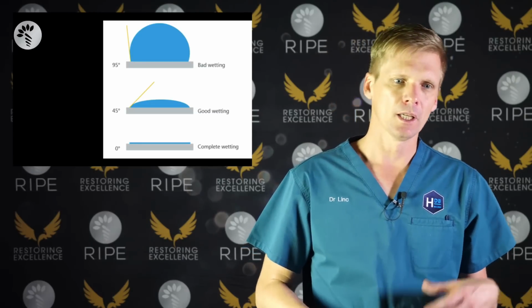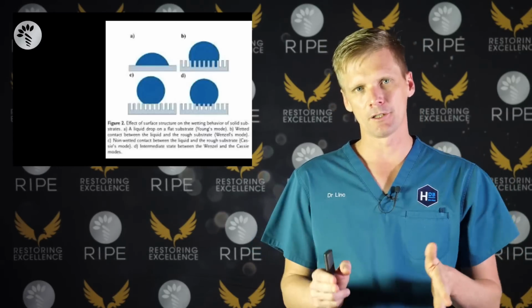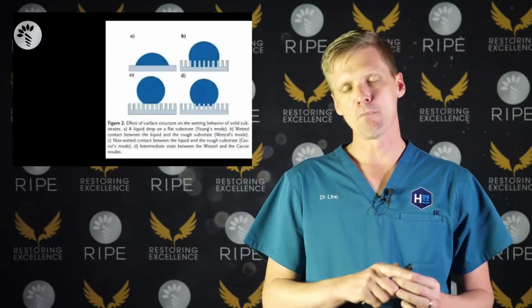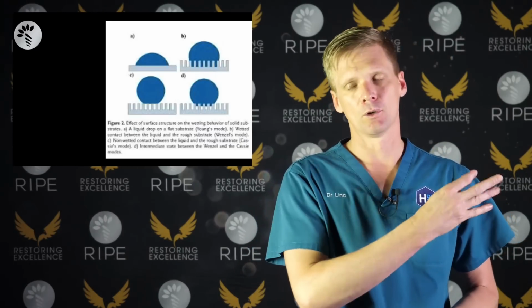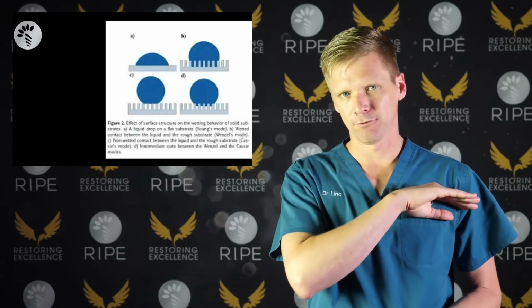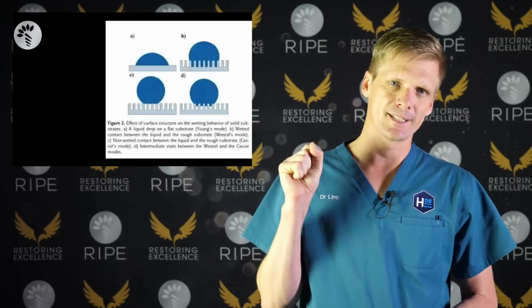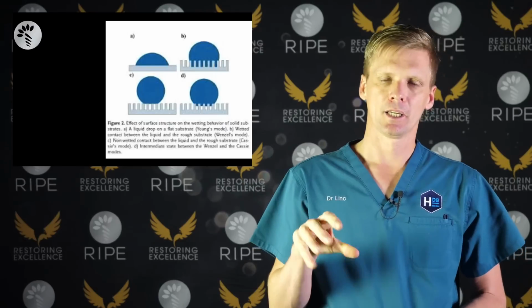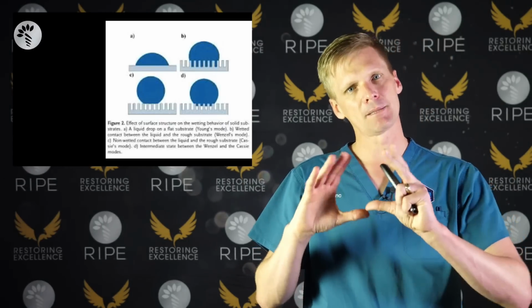Don't go into this diagram too much, but basically when you have a hydrophobic surface that's rough, it is much harder for a hydrophobic liquid, which silicone is, or a hydrophilic liquid, any sort of liquid, to flow over the surface when it's rough. So the issue is that silicone is much more likely to get a bubble if your prep is rough. I'm not saying it has to be shiny, okay?